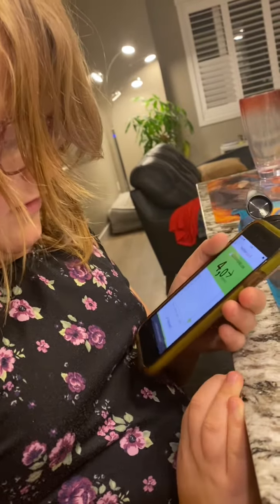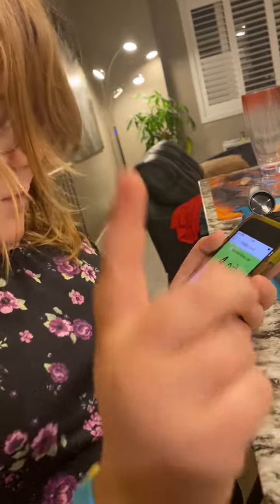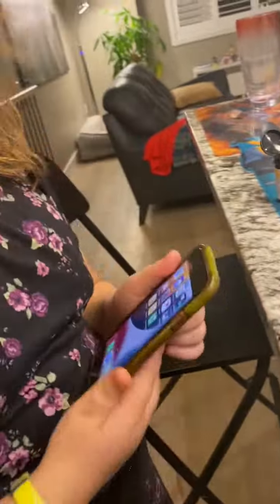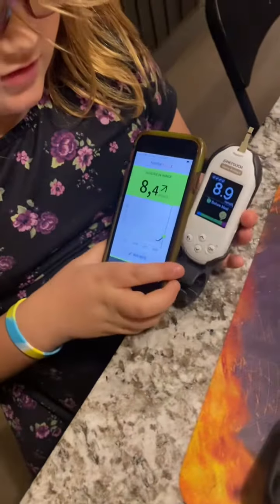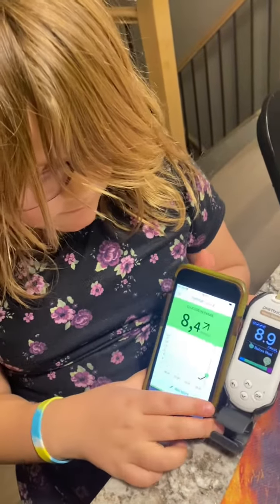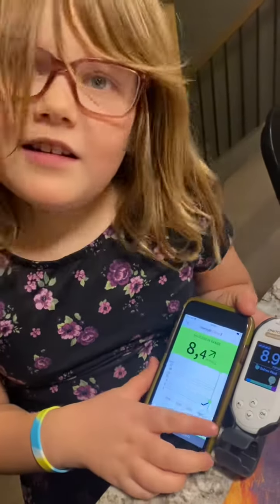That's a test, right? 4 — which is a good sign. So the sensor... Here is 8.9 now. This is Libre 3 — it shows it's going up. So we are getting ready for a long road trip.